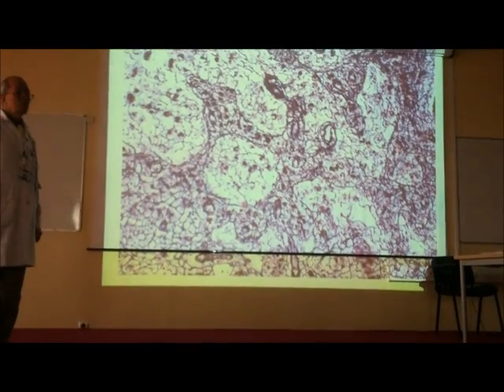You didn't take them. This slide represents a tendon. What is it formed of? Bundles of what? Collagen fibers. Collagen type what? Type 1. What is the type of collagen in the reticular fibers? Type 3. Okay?